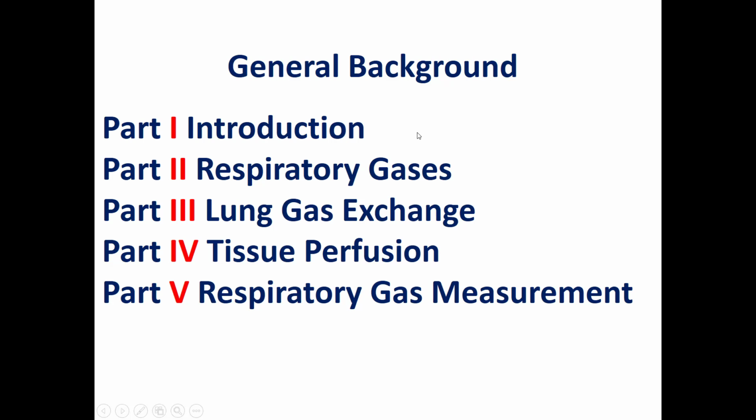Then we have a small introduction about the pulse oximeter, which is the topic of this lecture, as a non-invasive replacement to monitor continuously the oxygen saturation in the blood. When we talk about the oxygen saturation, we talk mainly about the oxygen saturation in the RBC. We are not talking about the partial pressure of oxygen in the plasma. We only talk about the oxygen in RBC and not in the plasma.